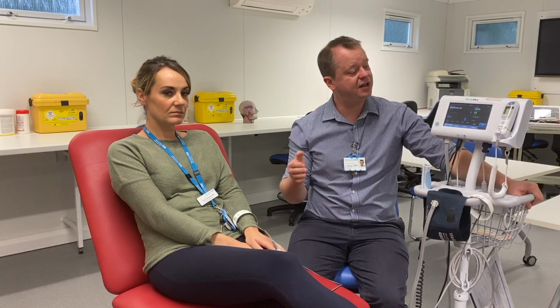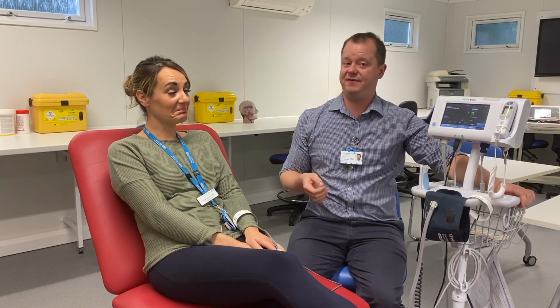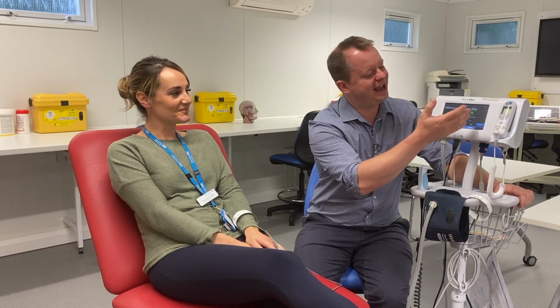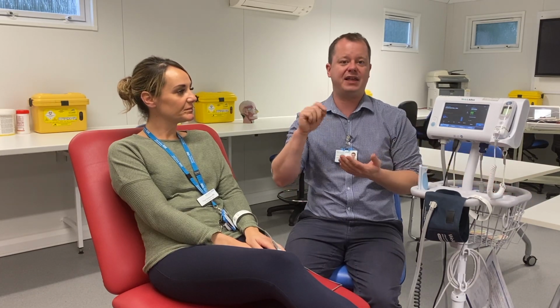Alongside her saturation of oxygen, you can see that you've also got Tina's pulse rate, or her heart rate. Because Tina is incredibly fit and healthy and runs all the time, her heart rate is a really healthy 50, 48 it was earlier. So we can also write that down as well.